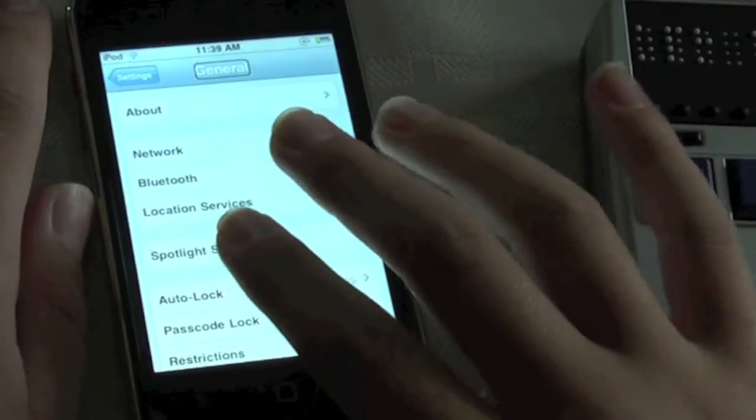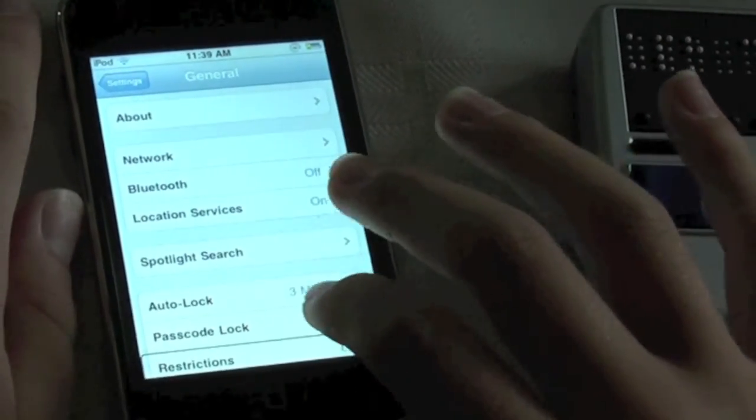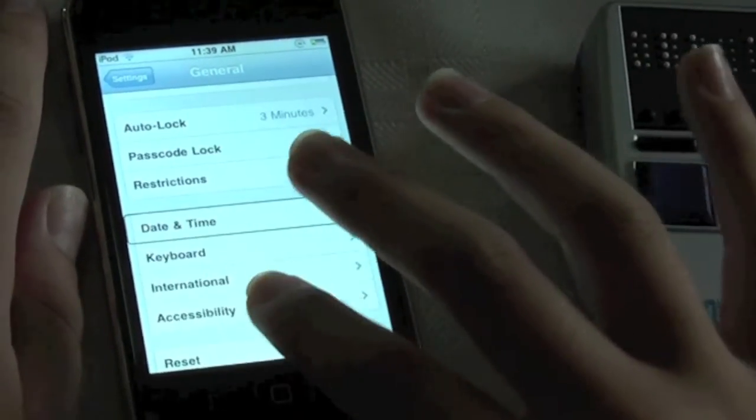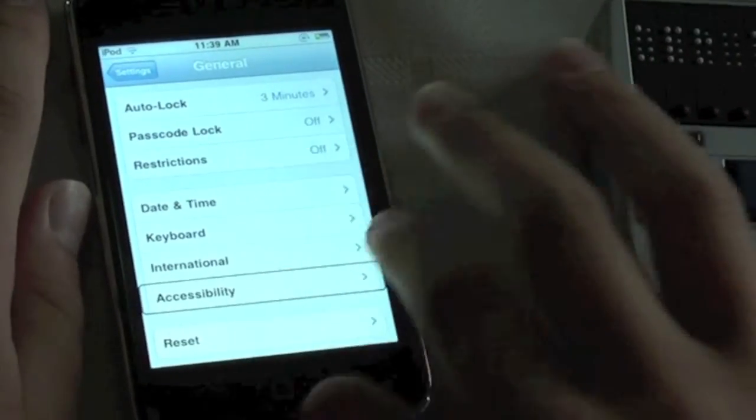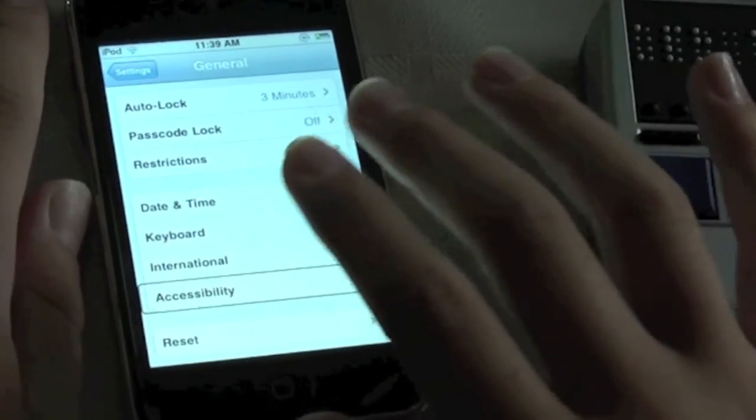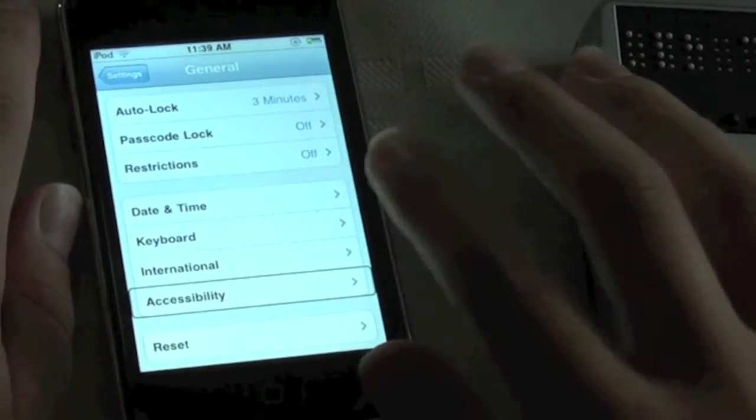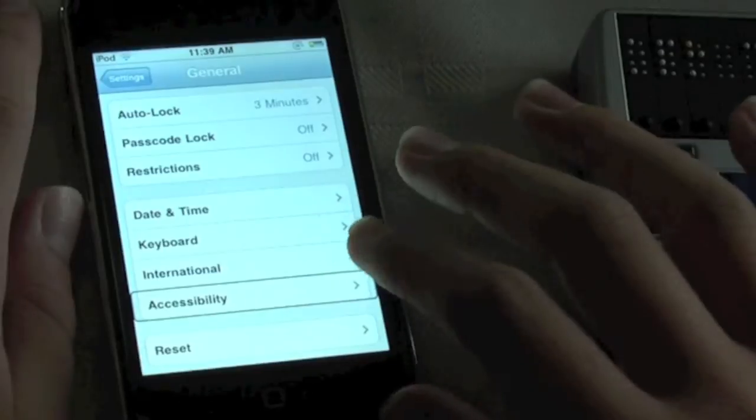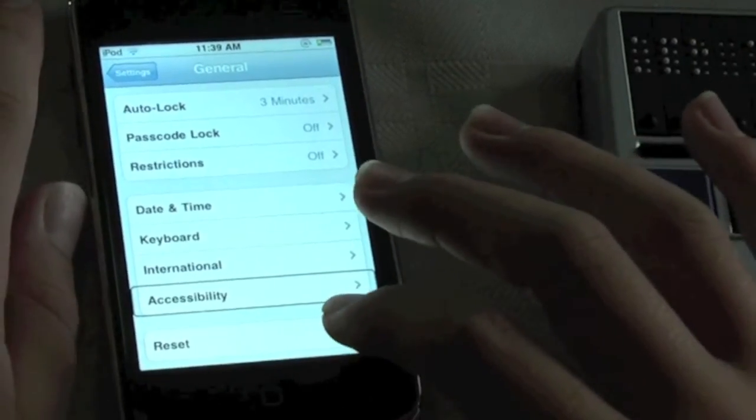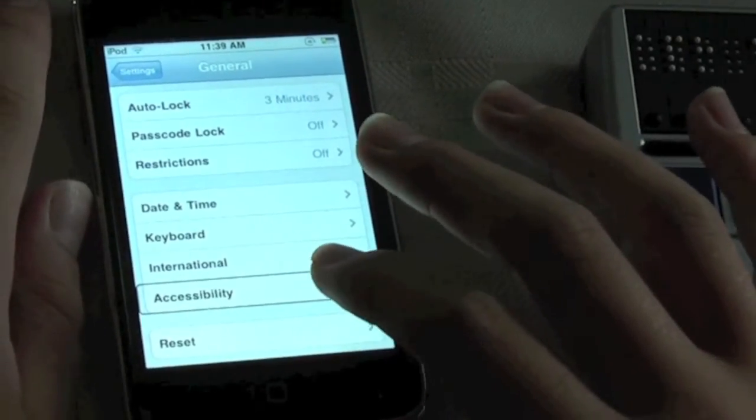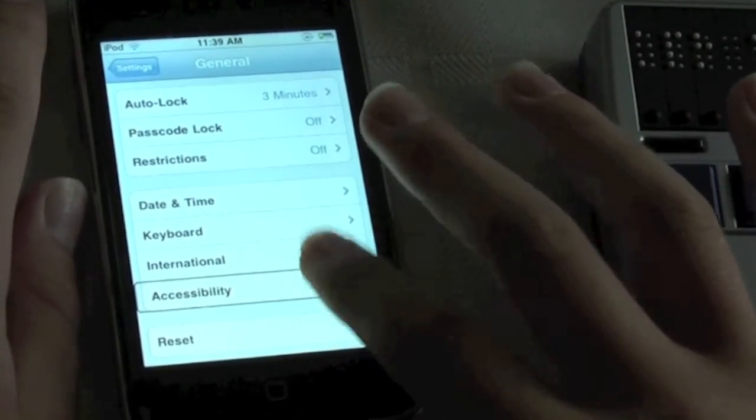What I did to get to Accessibility was I touched near the bottom of the screen and then flicked right until I got to Accessibility. Now I'll double tap.